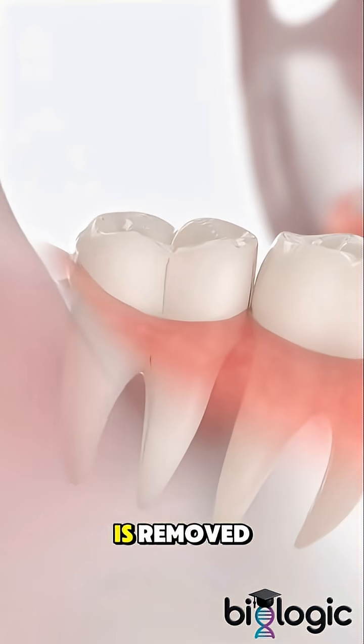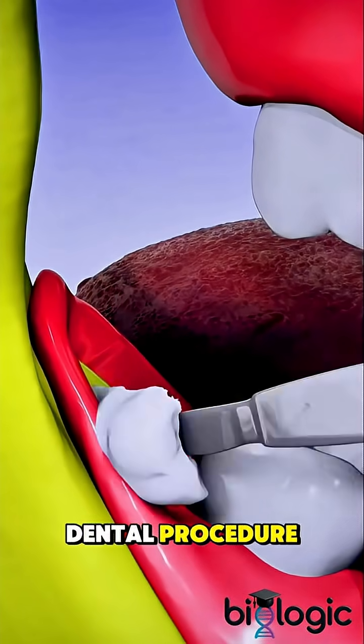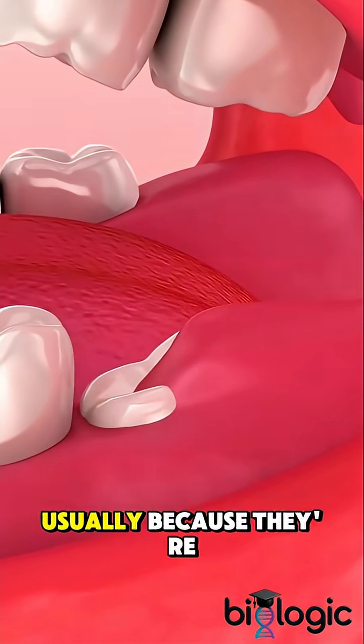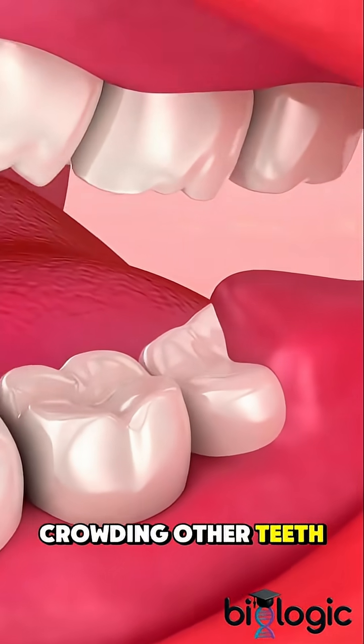Ever wondered how a wisdom tooth is removed? Wisdom tooth extraction is a common dental procedure to remove one or more third molars at the back of the mouth, usually because they're impacted, causing pain, or crowding other teeth.